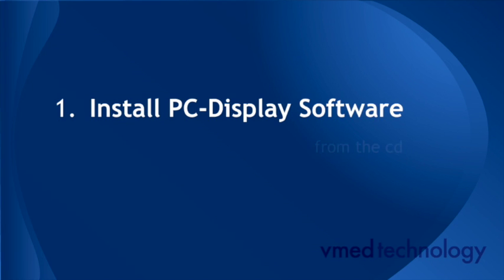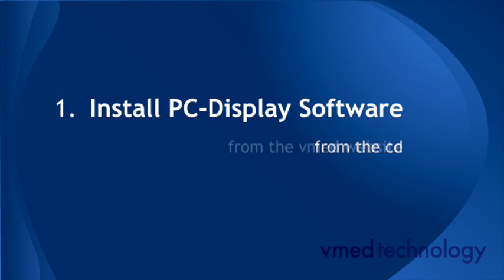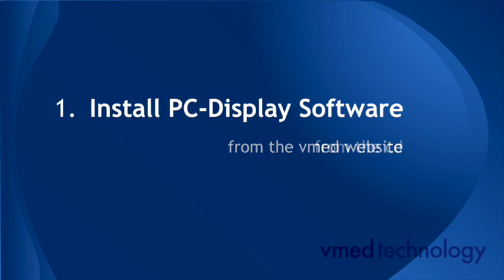You can either install that from the CD that came with your computer, or from the VMED website. We'll start by first installing from the CD.